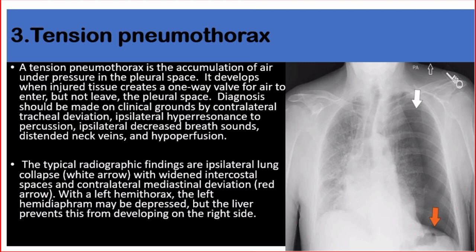With a left hemithorax tension pneumothorax, the left hemidiaphragm may be depressed, but the liver prevents this from developing on the right side.